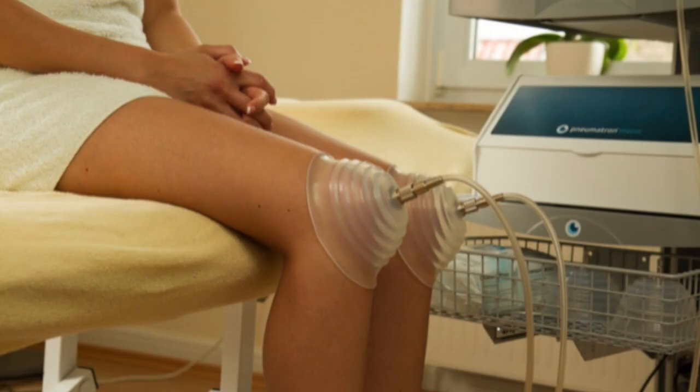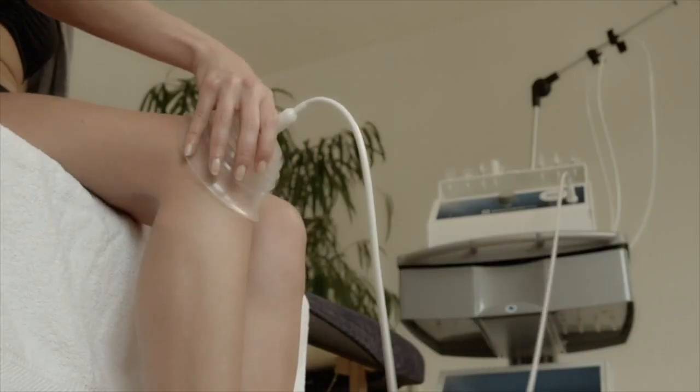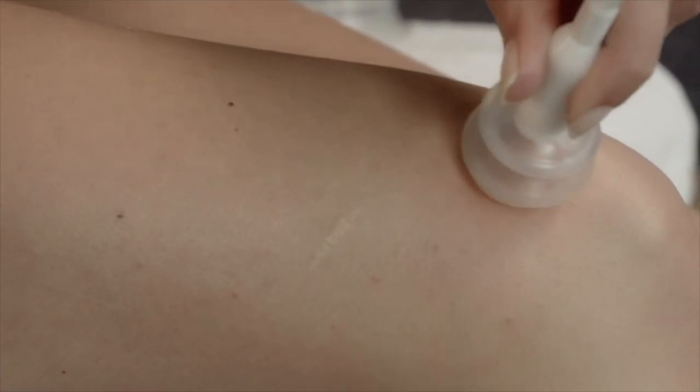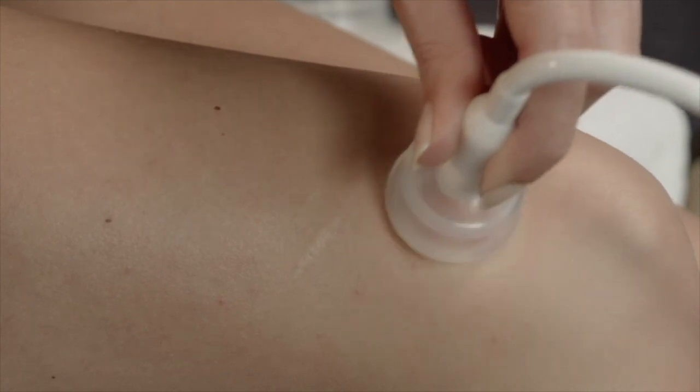At the bottom on the right, you can see a treatment directly on the joints. In this case, to treat osteoarthritis of the knee, one should sit in a slightly raised position so that one can easily move the knee during PPTM. Thanks to the pulsation and gentle movement, the cartilage is once more supplied with nutrients and synovial fluid. Since the cartilage is nourished by means of diffusion, it can capitalize greatly on the PPTM and the sponge effect to support the transport of nutrients necessary for the joint. Afterwards, treat the surrounding tissue of the joint as well to relieve tension in the muscles and eliminate tension in the fascia. When this tension is removed, movement of the joint becomes easier again. Pain can be slowly and steadily relieved, and the cartilage gets the nutrients it needs through movement.